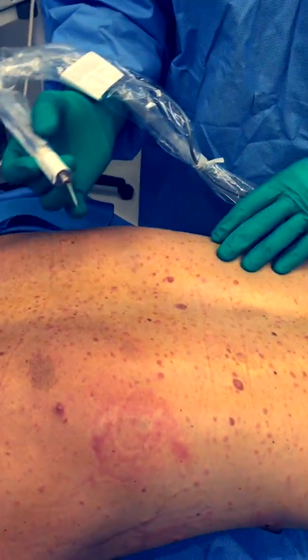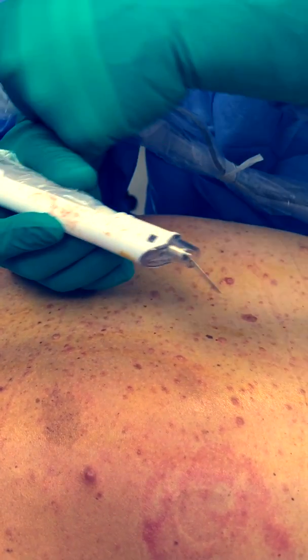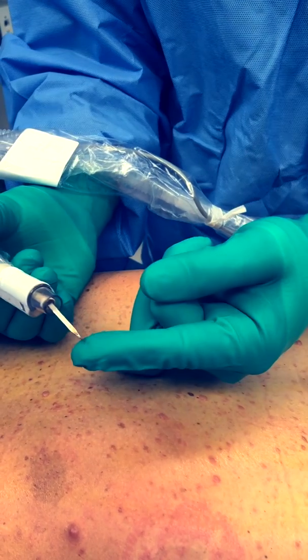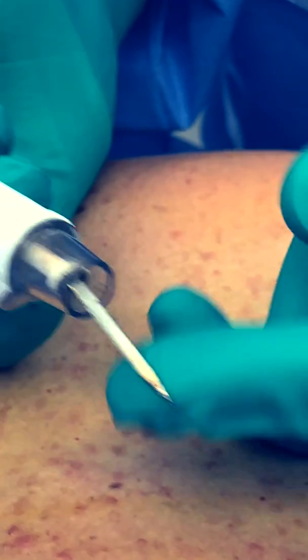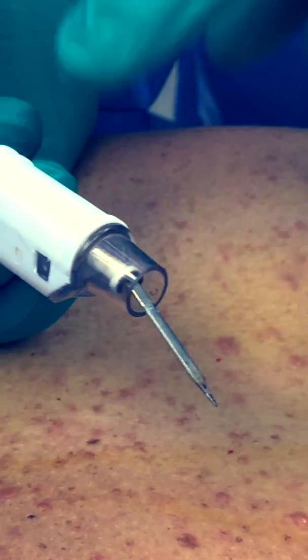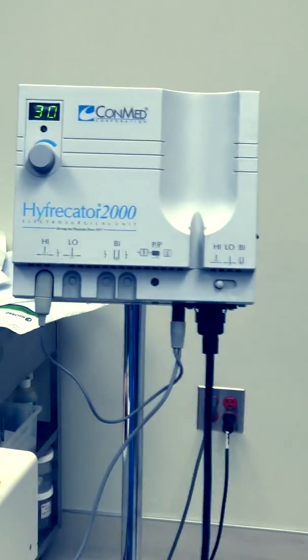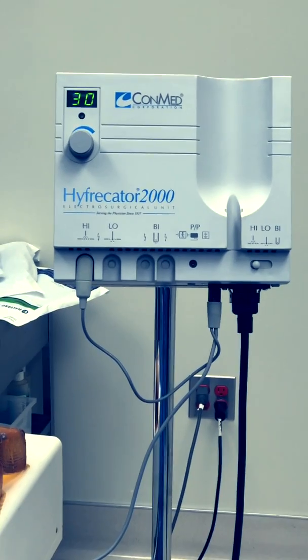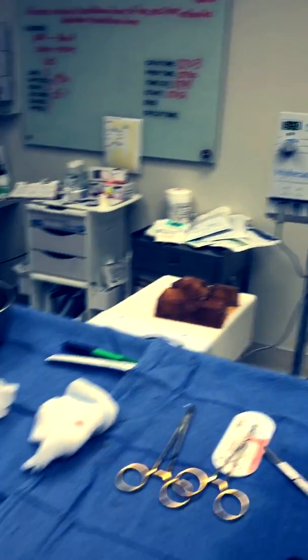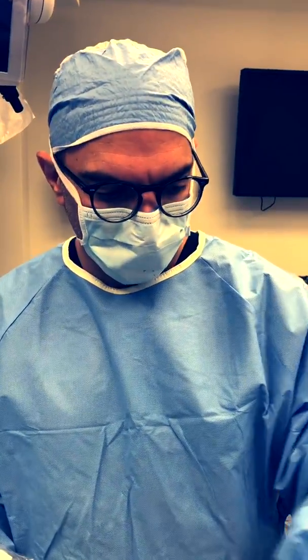We're getting ready to do electro desiccation on this patient. The probe itself is a Hyfrecator device — what I use to perform electro desiccation. It's connected to a suction cord which sucks away any noxious fumes that arise from the skin during the treatment. It has a very sharp point so I can penetrate deep into the tissues and get the nidus, or root, of the tumors. The device itself — the ConMed Hyfrecator 2000 — is a cautery-type device that emits a specific electric current applied to the probe, causing rapid dehydration of tissues within the field.